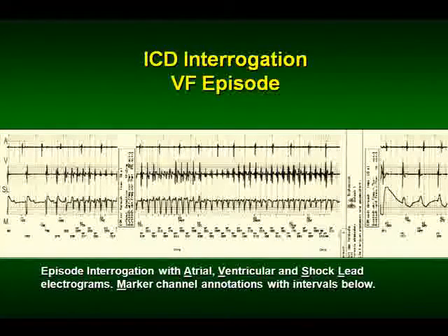We can also use the defibrillator to diagnose what happened. When defibrillators first came out, somebody would say, oh, I was walking along and pow, I got it. And we never knew what happened. We said, oh yeah, it saved your life. And we found out later it frequently didn't save their life. And so what they built in about 15 years ago is the ability to store the electrograms from an episode, so you can analyze it.